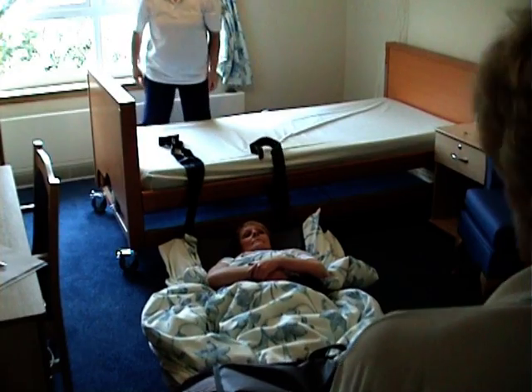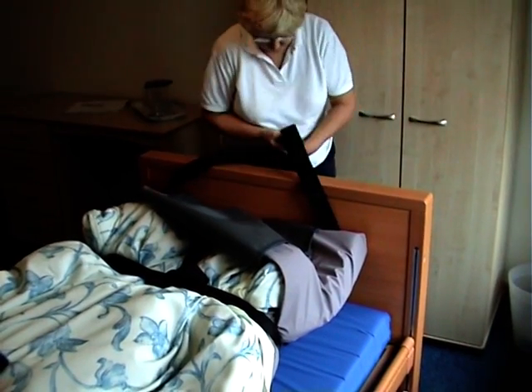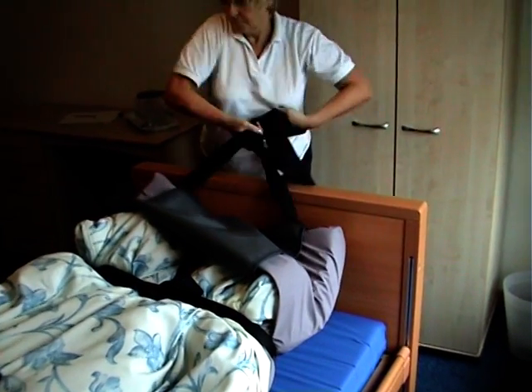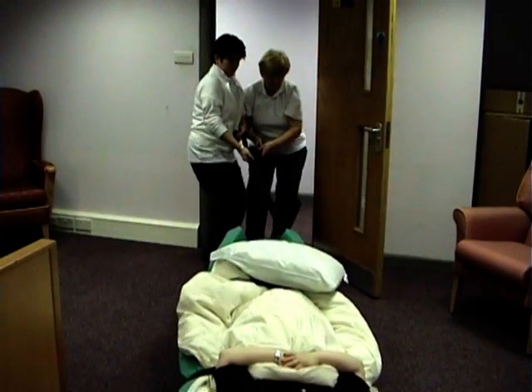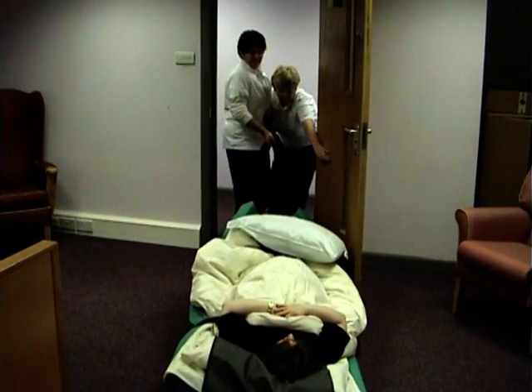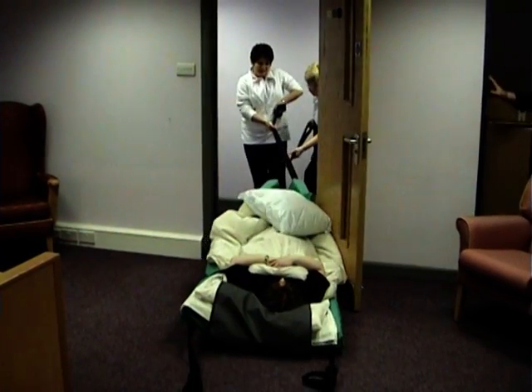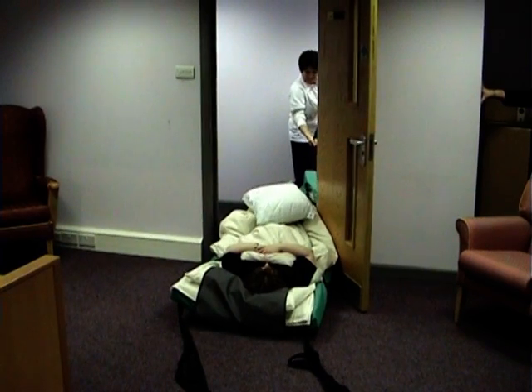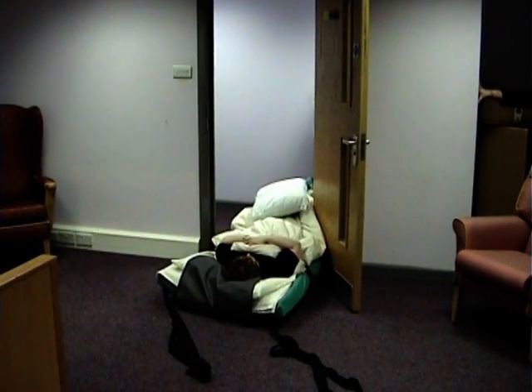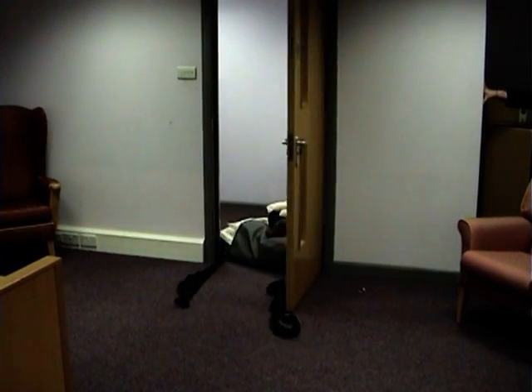The carer at the head end lets go of the straps. This move should be controlled and the base of the ProPad should be touching the floor, ensuring smooth movement with no impact. The second carer now comes to the foot end. With the straps still in the crossed position, both carers take one strap each and head backwards towards the door, pulling the ProPad. Remember, the door will be closed. Keeping the straps crossed will make it easier to negotiate through narrow spaces.